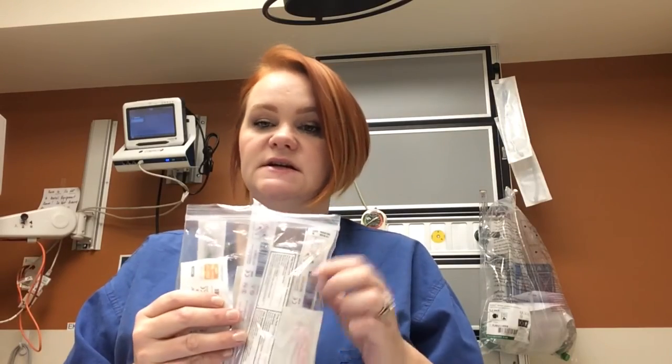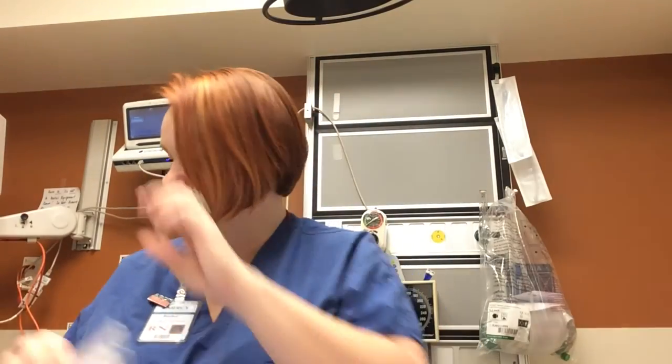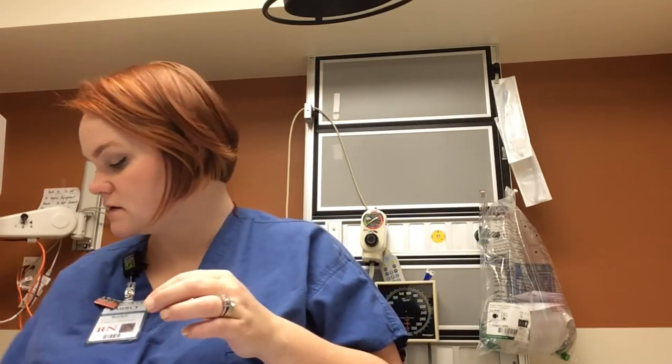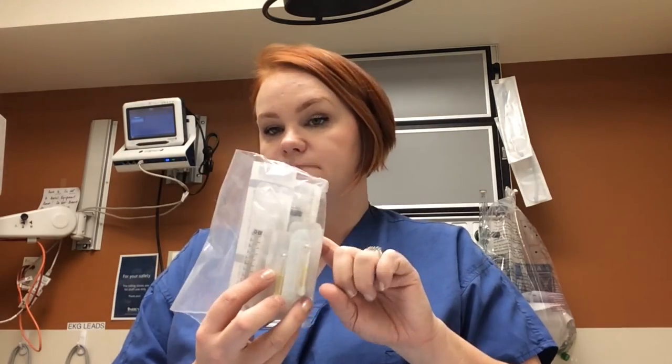There's extra needles in here. There's extra syringes in here. There's a bag with sutures. There's also, like I said, a bag with extra syringes if they would need it.